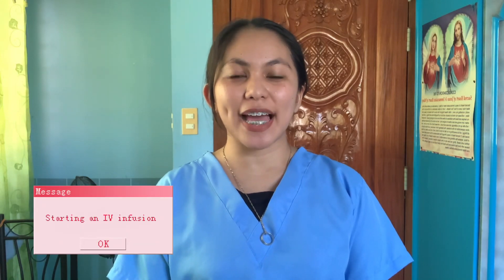Hi, I am Precious Machas, BSN 2-2. Today, I am going to perform a starting an IV infusion.